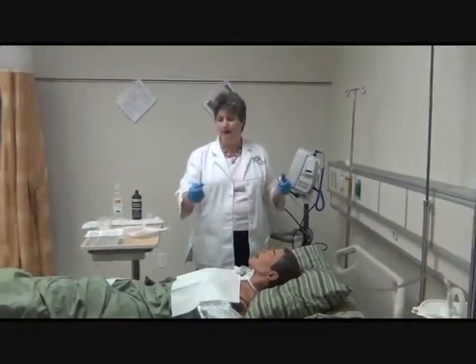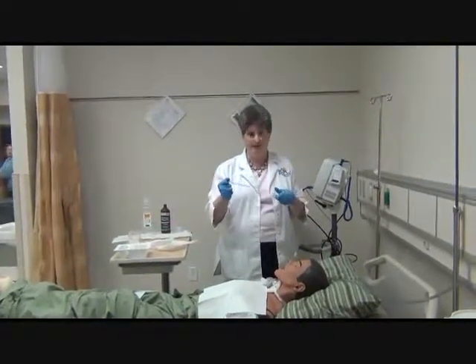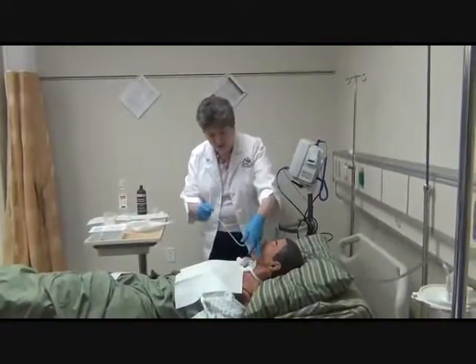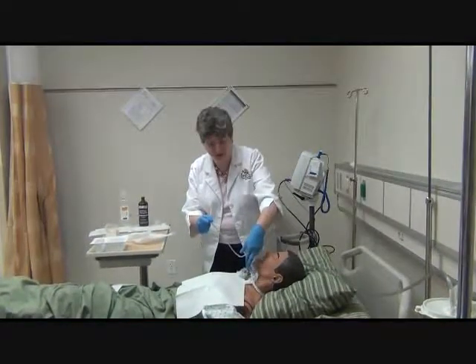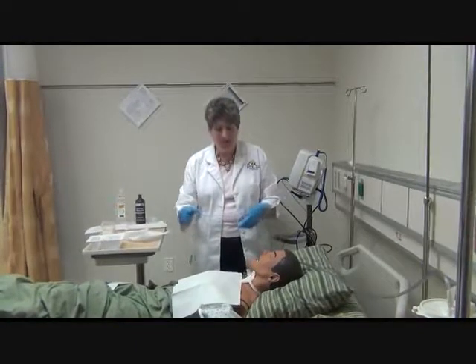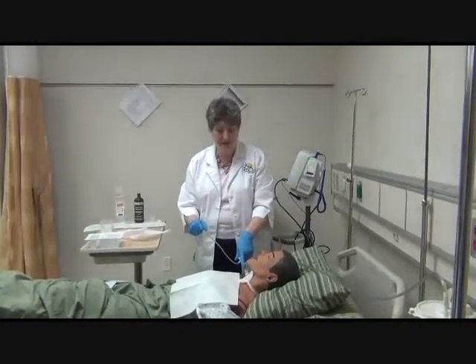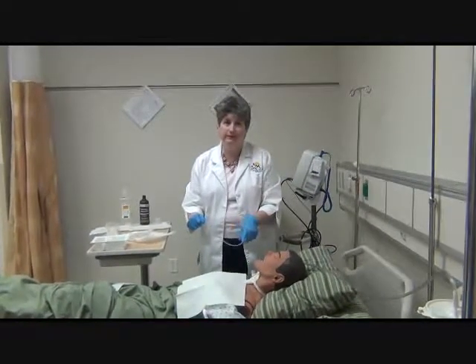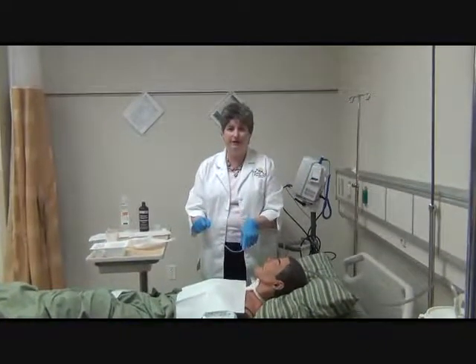And again, while I talk to the patient, I'm going to protect the end of that catheter with my hand, the part that's going to go into the patient. In the meantime, while I'm setting this up, the patient's hyperoxygenating. I'm going to take this away. I may need to add a little saline packet, so I want to do that just a little ahead. They come as a little package with 1 to 3 cc's of saline in it. You can drop that in to help thin out the secretions.